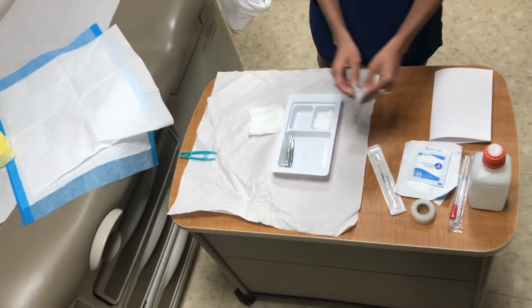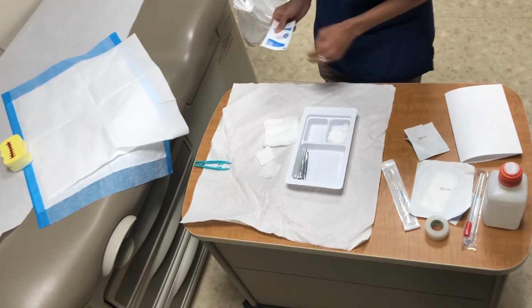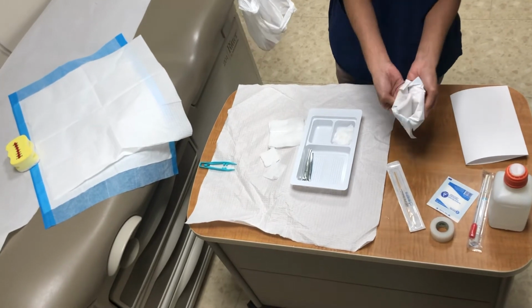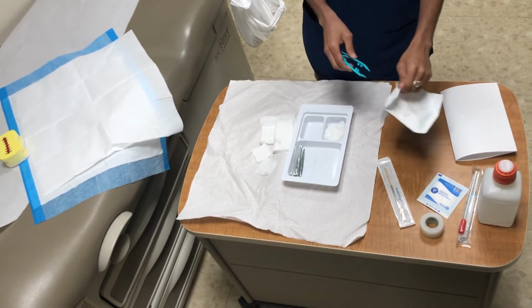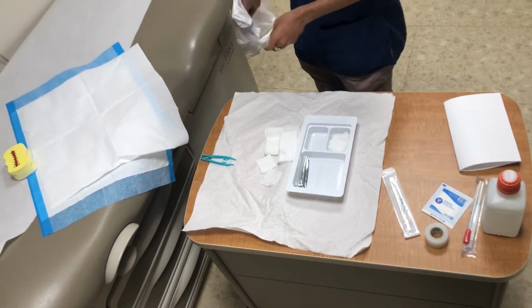And then I'm gonna add additional supplies. I'm adding a 2x2 gauze, some extras. I'm gonna put some more here. I'm gonna throw this out in the garbage. I'm gonna put some 2x2s, I'm gonna peel it. I'm gonna take one out, add it here. I'm gonna probably take another one, add it there. Put this back, I'm gonna throw that out.